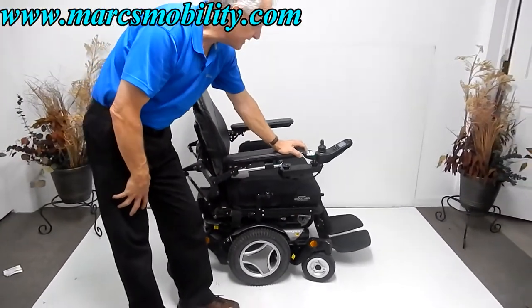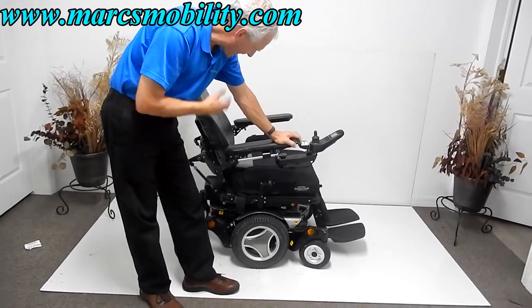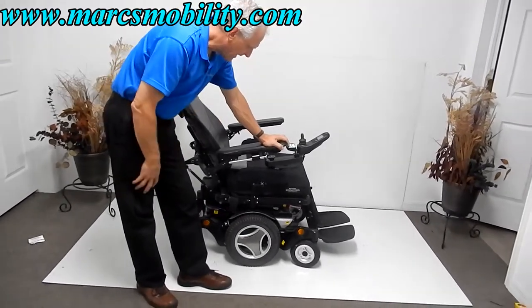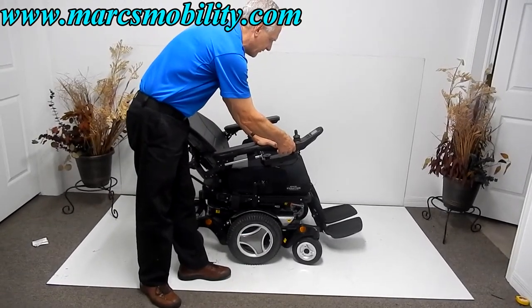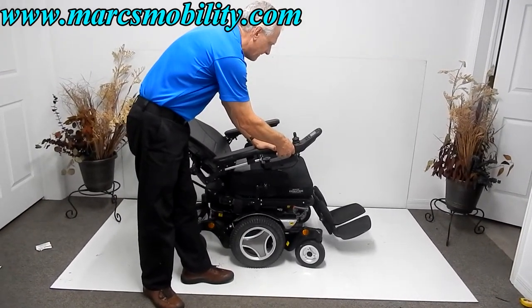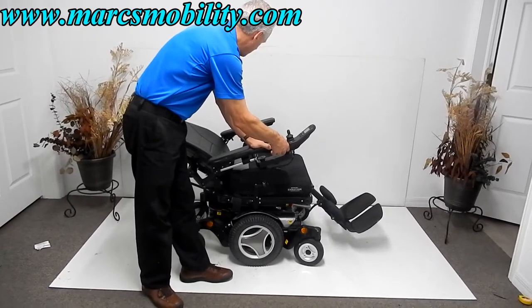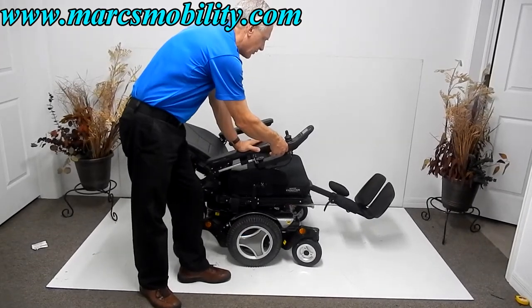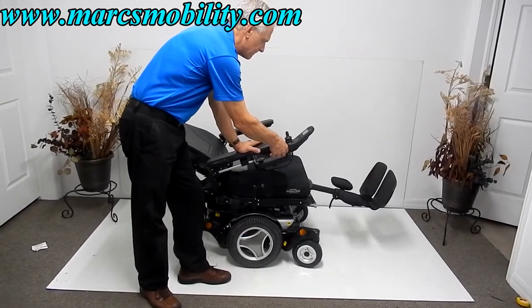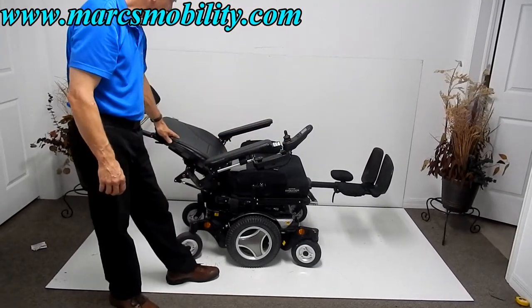Now I'm going to show you the electric recline. This is your electric recline going back. You can also make the legs go up at the same time if you want — you would need to use two fingers at the same time. So I'm making the back go back and the legs go up right now. You're pretty much flat here, almost fully reclined.